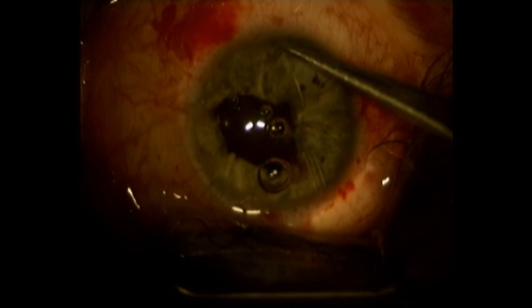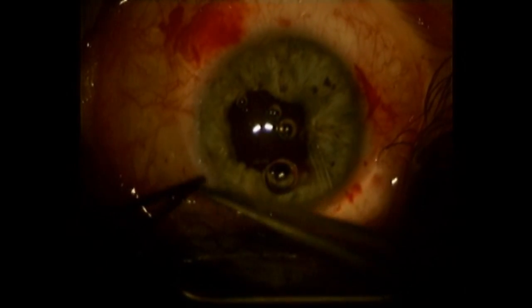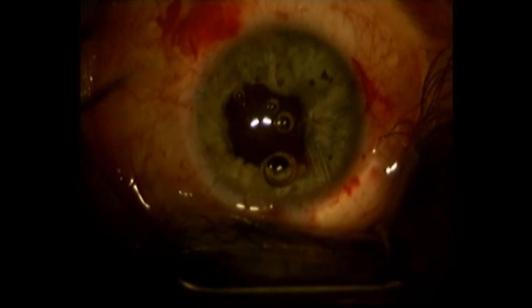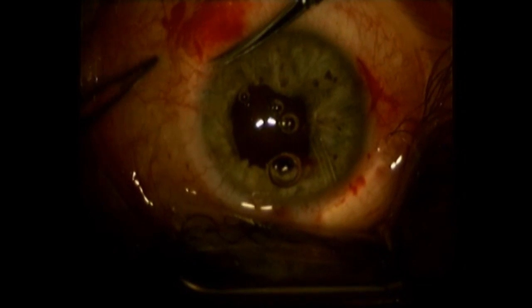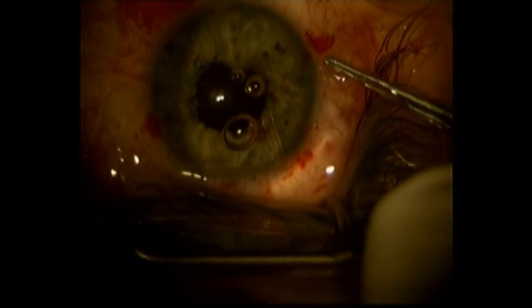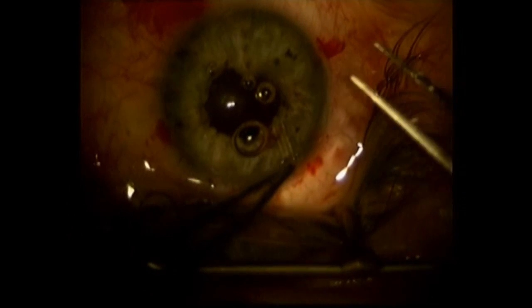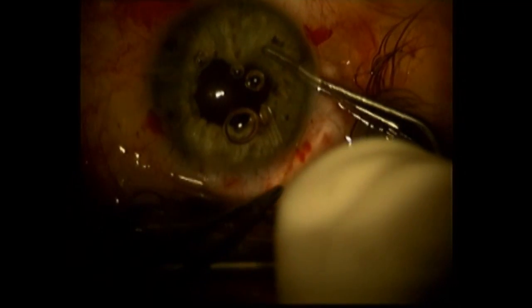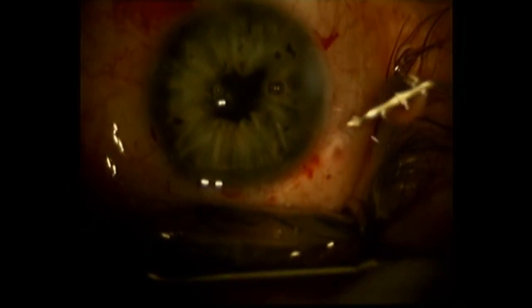Initially it'll look a little bit geometric, sort of non-circular. This will tend to round up a little bit over time, unless you have an unusually atrophic iris. The patient did remarkably well postoperatively, and even the little bit of geometric irregularity becomes a lot less noticeable over time as things round up — certainly very greatly improved over the preoperative condition.